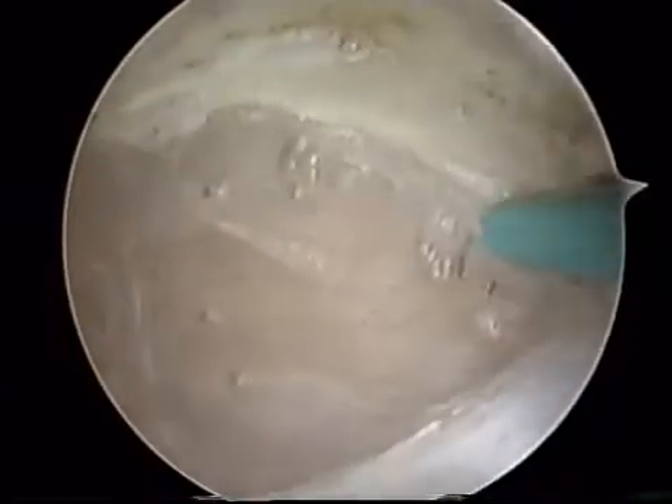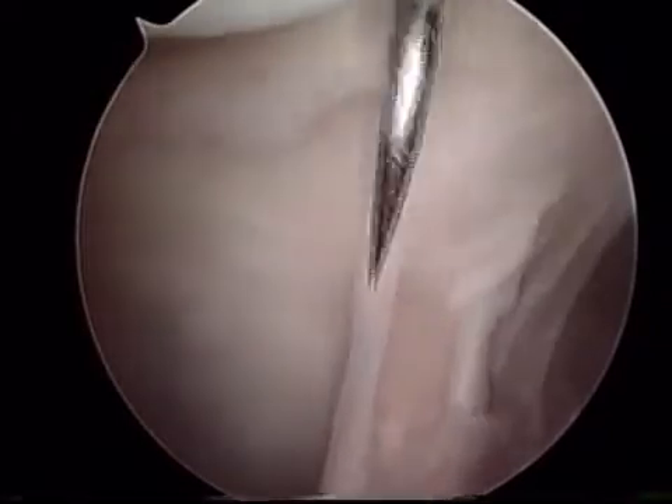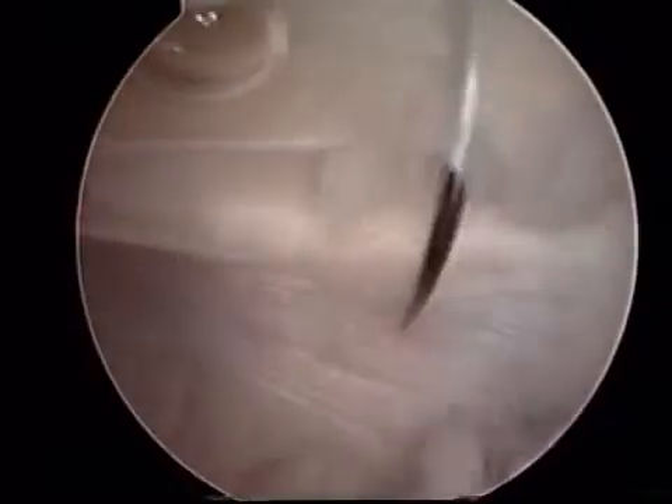In addition, we will also need to tighten the medial or inside part of the kneecap to realign the whole patella itself. Here we are on the inside part of the knee. We are introducing sutures from outside in and looking from inside the knee to imbricate or tighten the medial retinaculum.